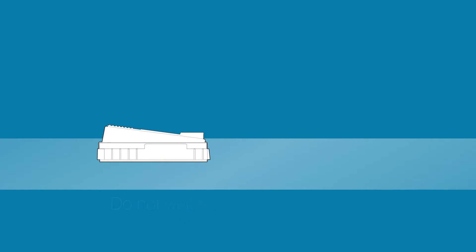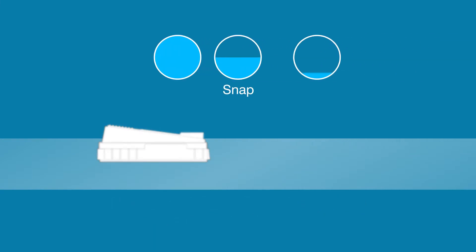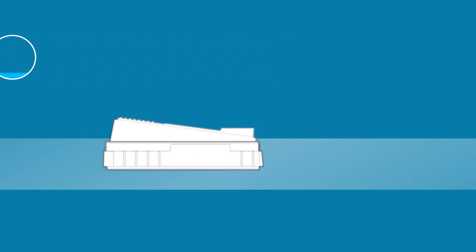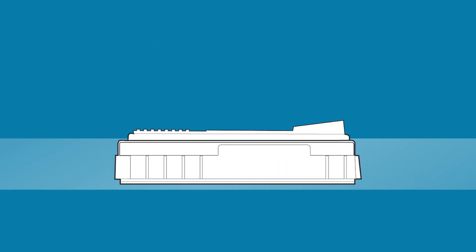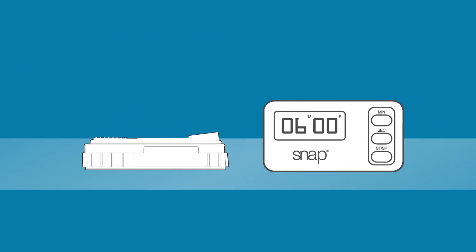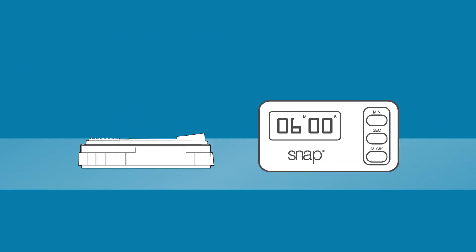When the sample appears in the activation circle, press down firmly on the device. Do not let the blue circle wash away completely.